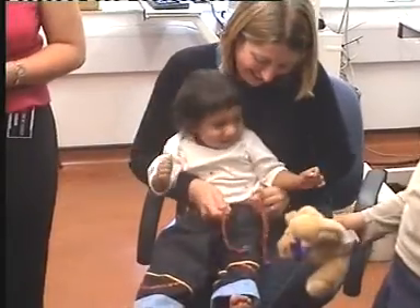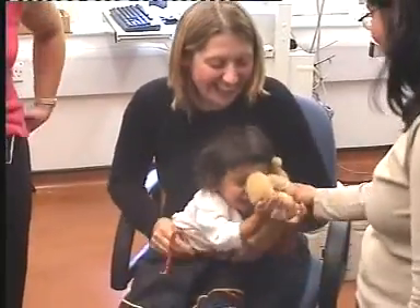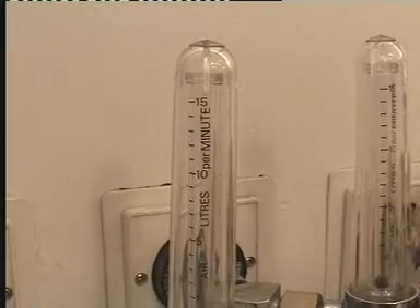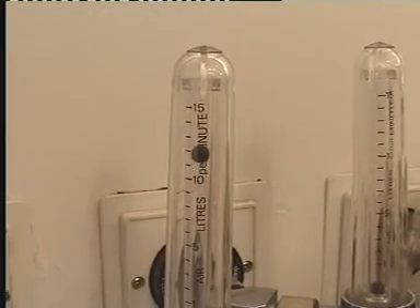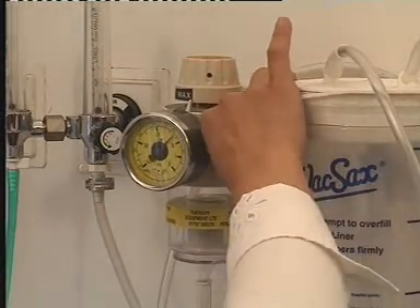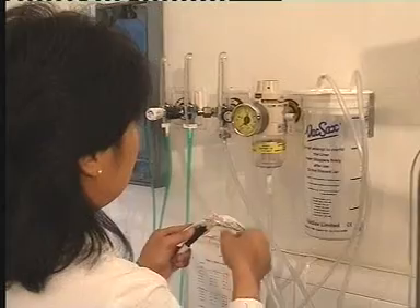The parents will be asked to try and keep the baby awake on the way to the hospital, so that the baby settles as soon as possible after arrival. On the day of the lung function tests, it's important that two skilled trained staff are present and that the resuscitation equipment is checked.